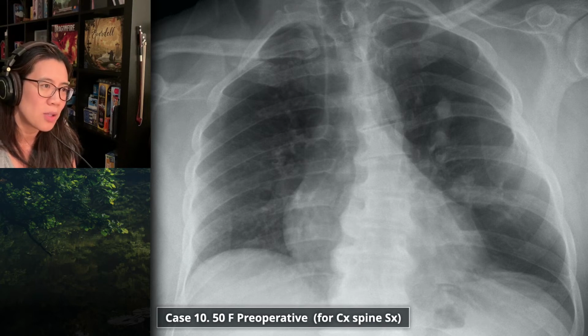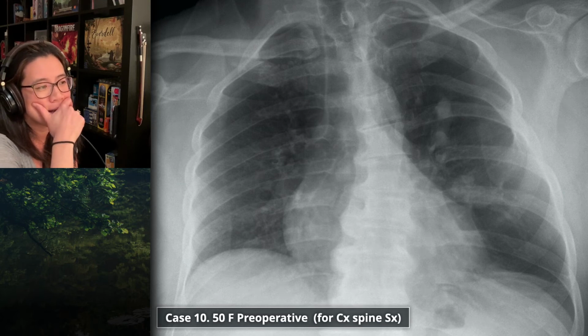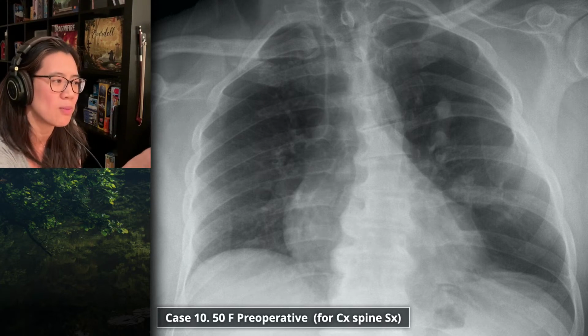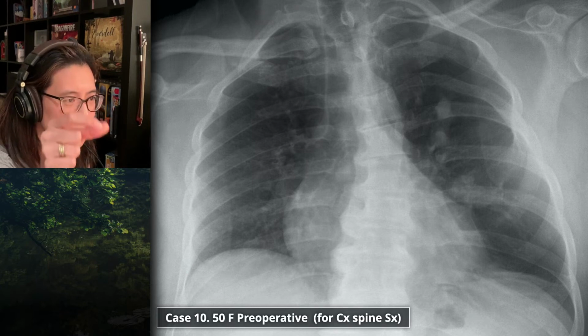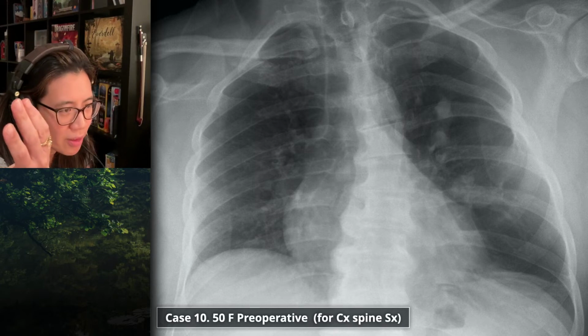Okie doke. The problem there is that you're using what I call jargon terminology again. Peripheral pruning, you usually use that to describe what? A pulmonary vessel with peripheral pruning is pulmonary hypertension. That's right. That's why I'm getting myself confused. But this is not that. Okay, all right. So what are we really seeing here? Keep it simple, descriptive terms. I'm not seeing the peripheral vessels well, and I'm seeing the central vessels too big, for want of a better description.